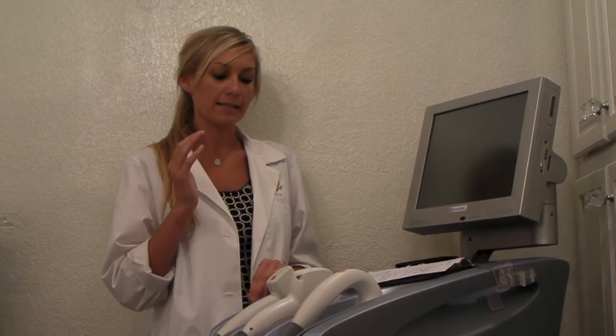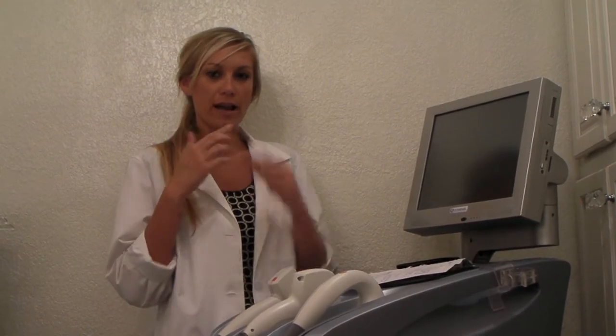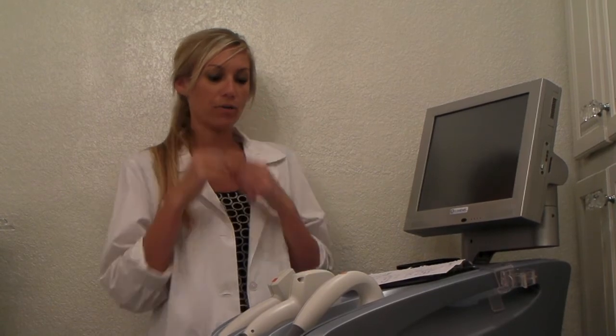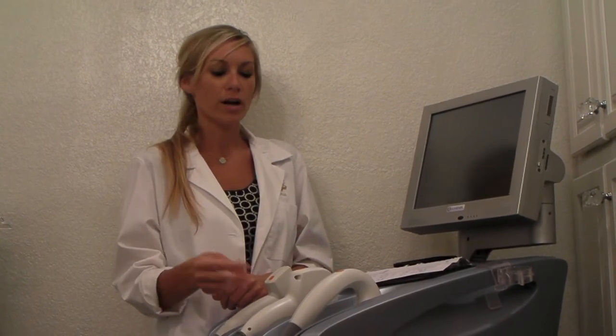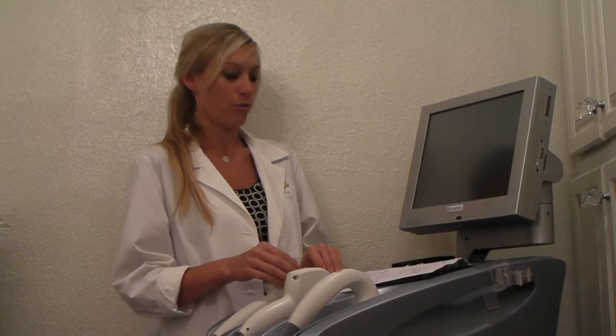Another big thing in a lot of our clients is their medical history as far as cold sores. If someone has a hormonal imbalance and they're having their facial hair removed by the Lightsheer, sometimes the energy and the wavelength in the Lightsheer can kind of exacerbate some inflammatory response that will cause a cold sore. So if you have a previous history of a cold sore, we'll prescribe antivirals and get that treated so that we can prevent it before it will happen.